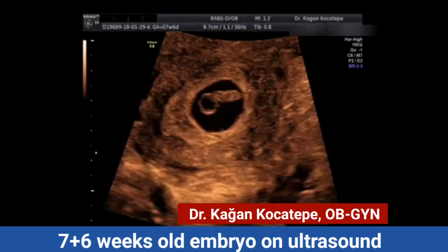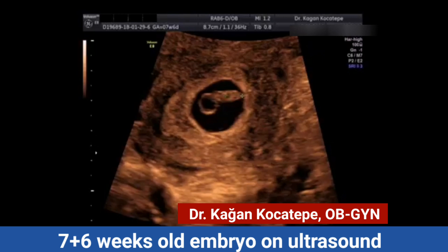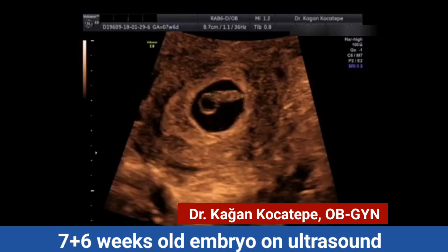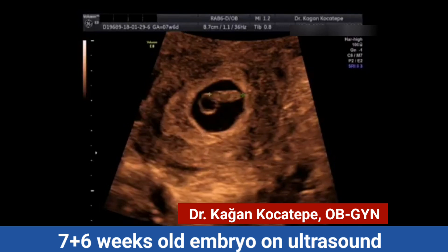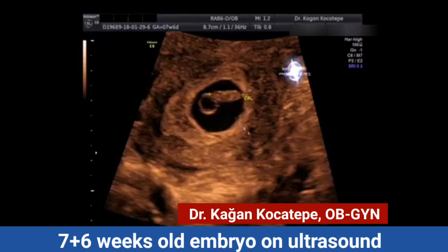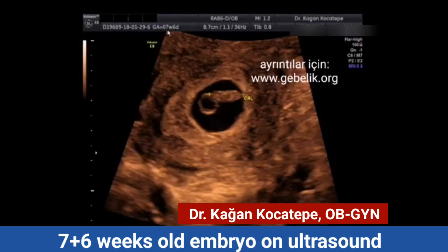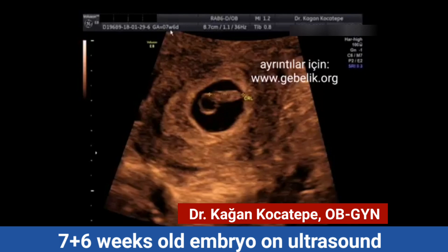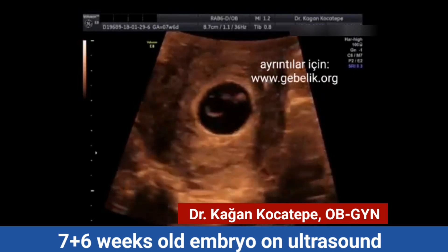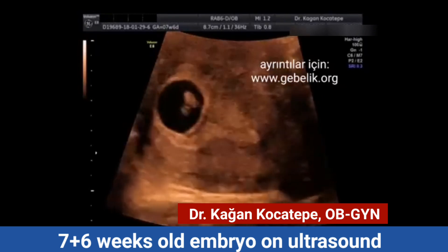Now we are about to measure the CRL — the crown-rump length — which will give us the week of gestation. You can see the CRL measurement and the actual gestational age calculated from the first day of the last menstrual period.